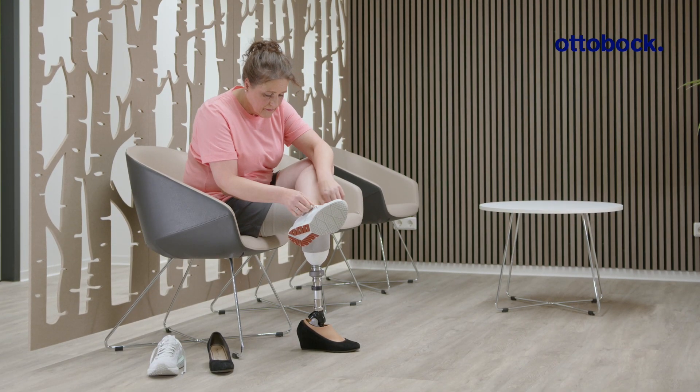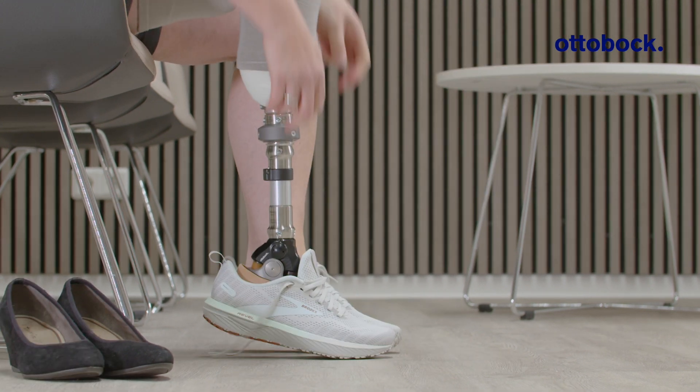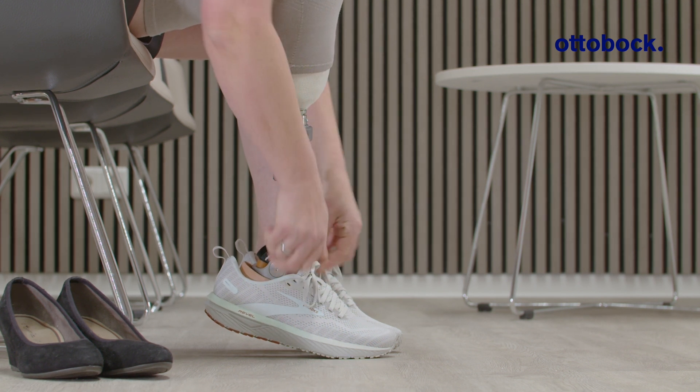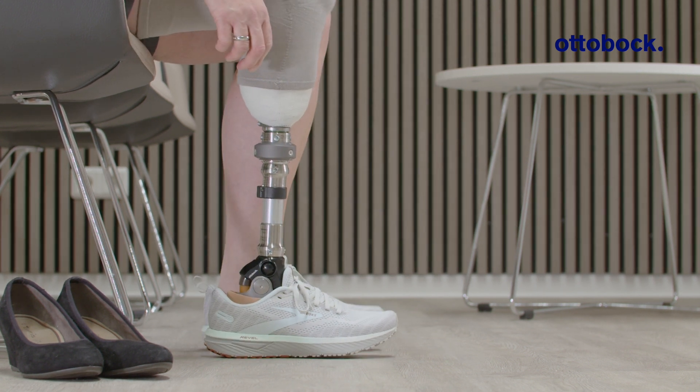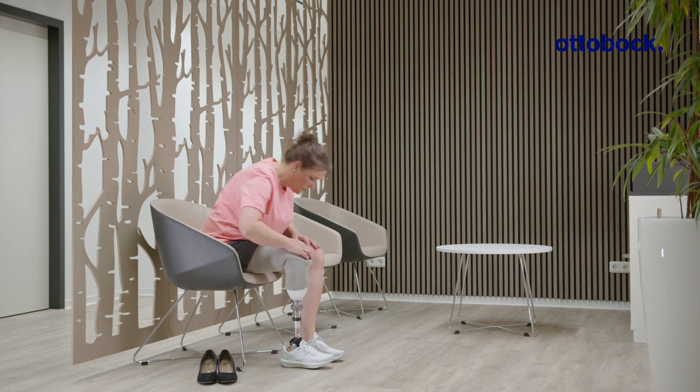During the first fitting, practice the adjustment using shoes with different heel heights. To adjust the heel height, unlock the ankle joint, set the heel height, and then lock again by pressing the button at the ankle axis.